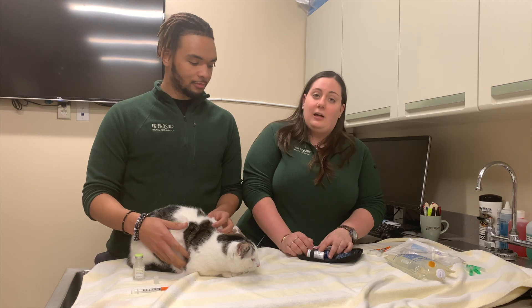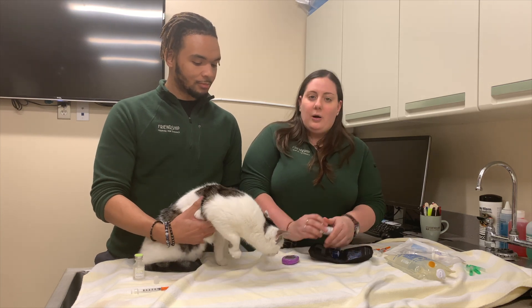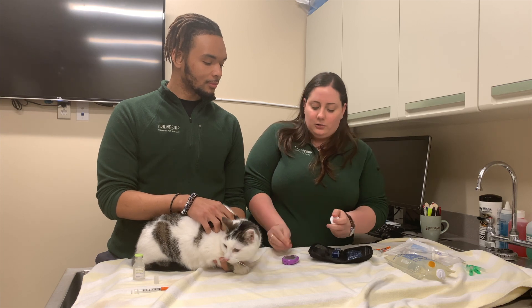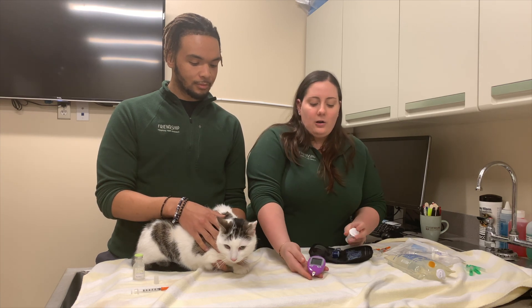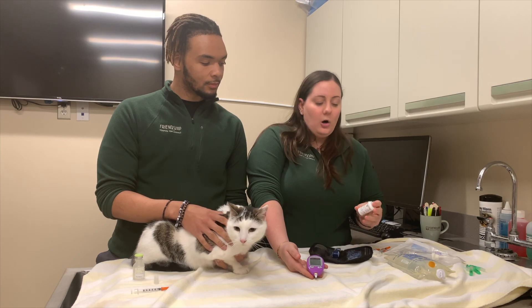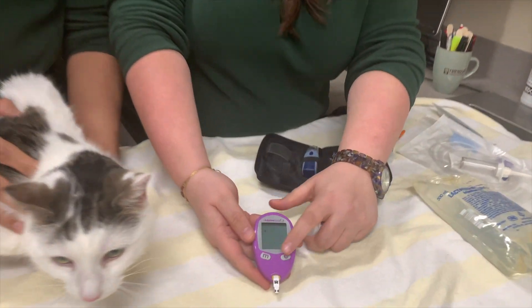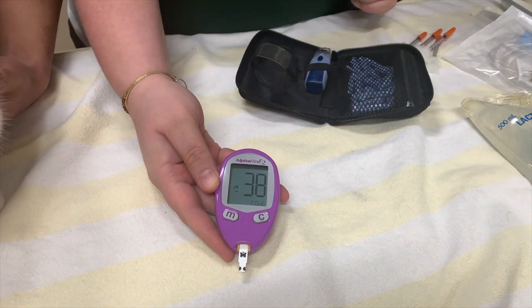Brandon is going to hold Butch for us and we're going to get our glucometer ready. We take one strip out of the container and put it into the glucometer. On the glucometer we'll see the code pop up. The code for cats on this one is 38, so we just change the code and now we're ready to go.